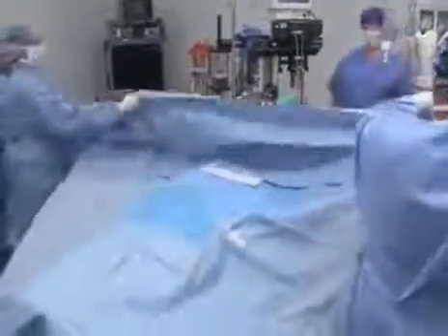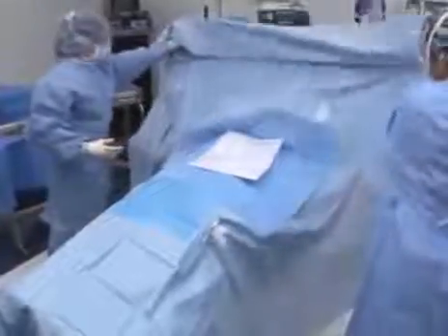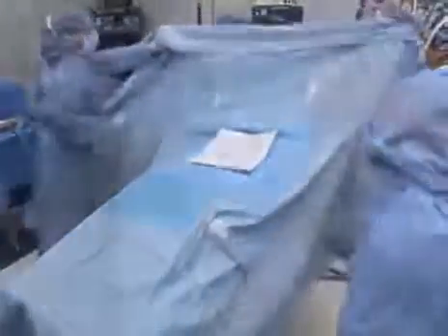To protect the gloved hand during draping with flat sheets, grasp the edge of the sterile sheet and roll your hand inward. This forms a cuff. Position the drape and release the edge of the cuff.